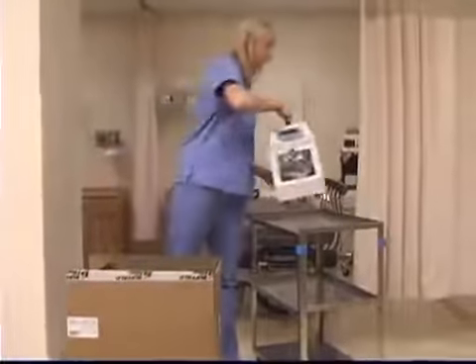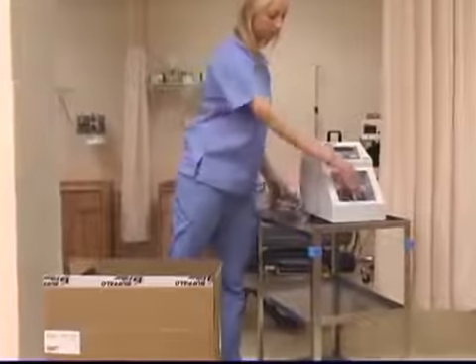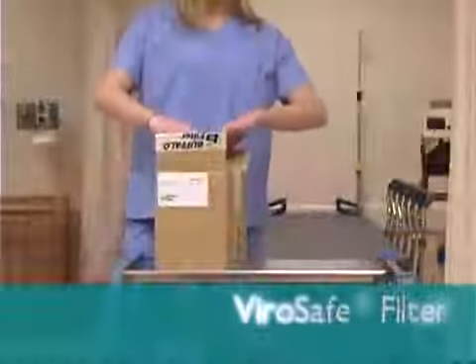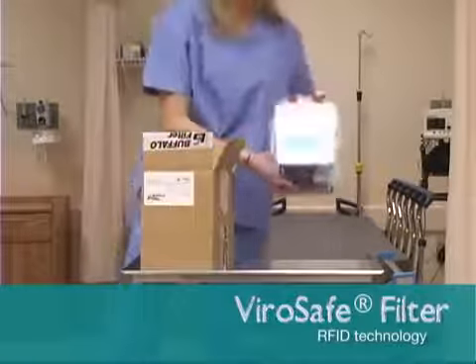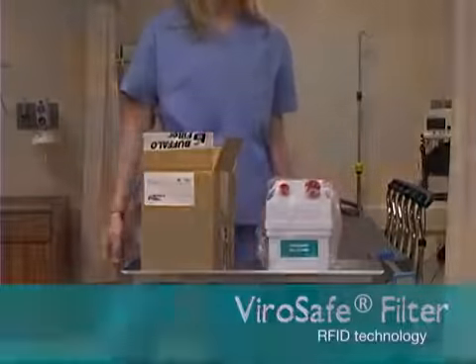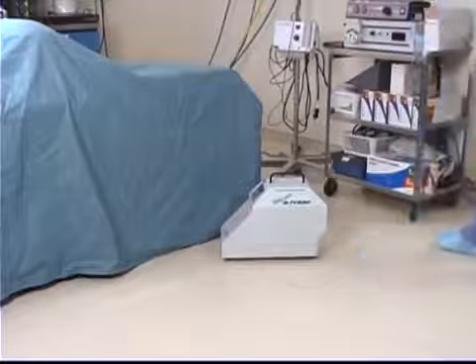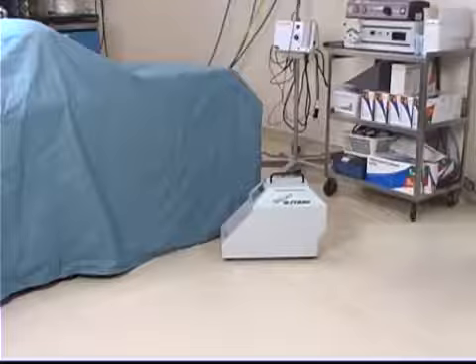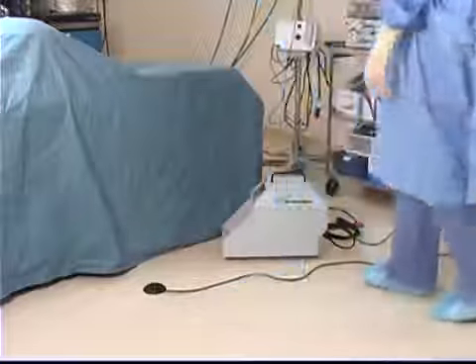The Whisper Turbo AutoSense arrives to you with the smoke evacuation unit, a power cord, pneumatic foot switch, and an operation manual. A Buffalo Filter ViroSafe filter with RFID technology, sold separately, is required to operate the system. To set up your Whisper Turbo AutoSense, first determine which location will be appropriate to place your unit, keeping in mind that your power cord must run to a grounded receptacle, the pneumatic foot switch must be placed for easy operation, as well as the tubing placement.